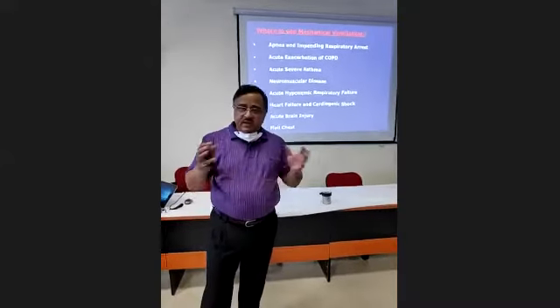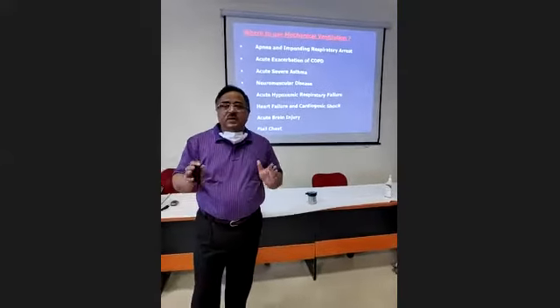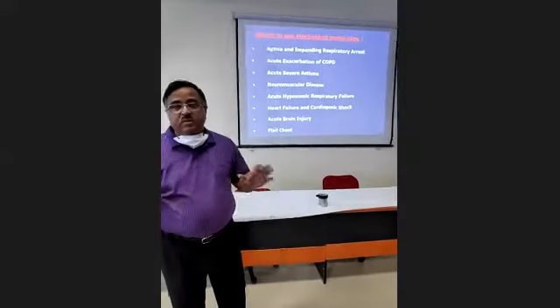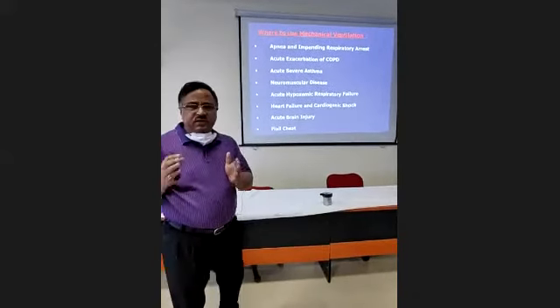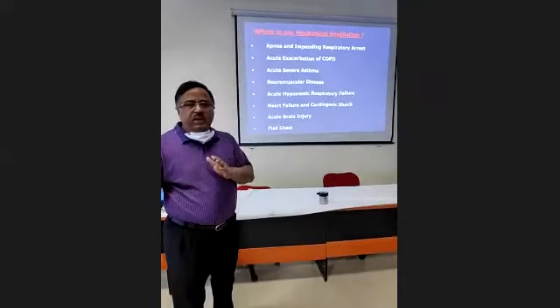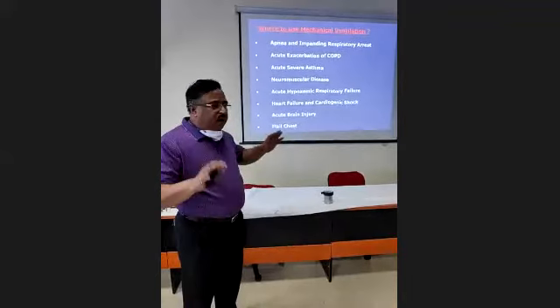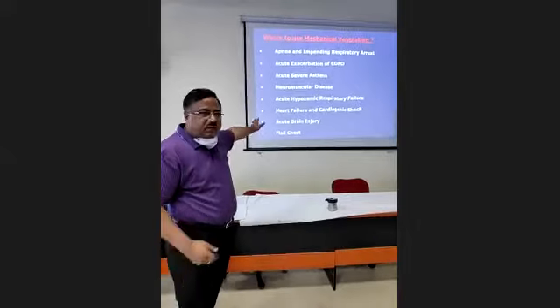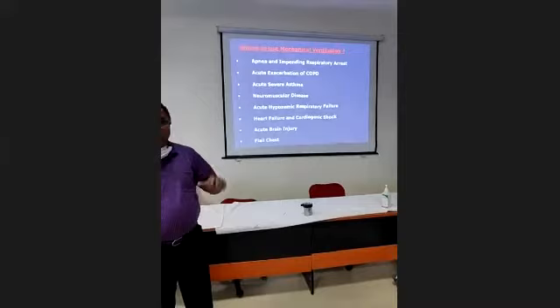Then there are indications after surgery and during surgery, because nowadays 100% of general anesthesia cases are conducted under mechanical ventilation in the operation theater. So there are hundreds of such indications. If you go on counting one after another, so many conditions are all indications for ventilation. Here are some of those which have been mentioned. So you can decide on your own whether this patient requires mechanical ventilation or not.